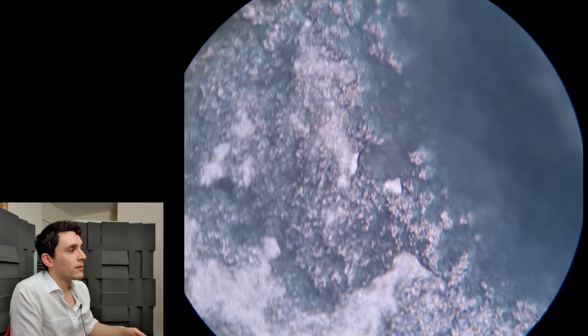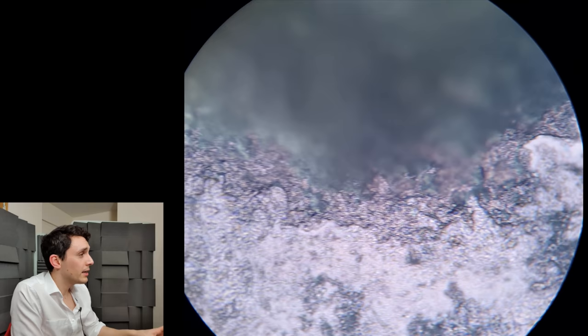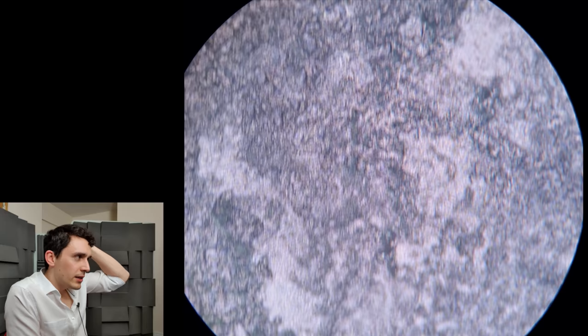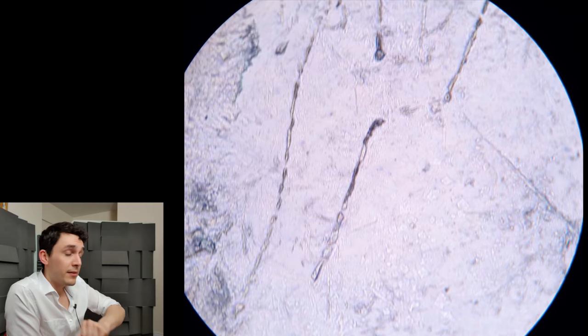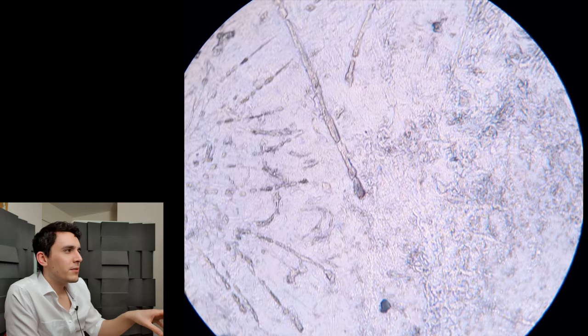All dead skin. And if we move just to the right, we'll start to see the debris clear and — well, there it is. This is a section of the microscope slide where I was able to smear it thinly enough such that the potassium hydroxide has dissolved all of the dead skin, and we're left with these thin filaments or hairs — but they're not hairs. This is fungus.